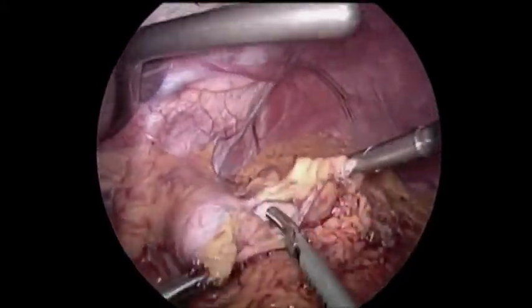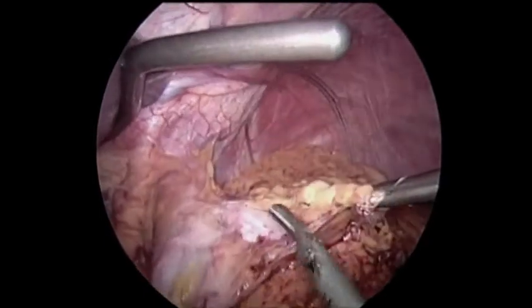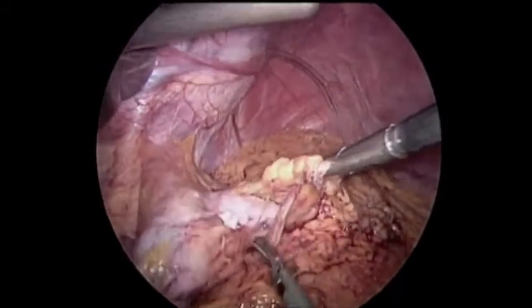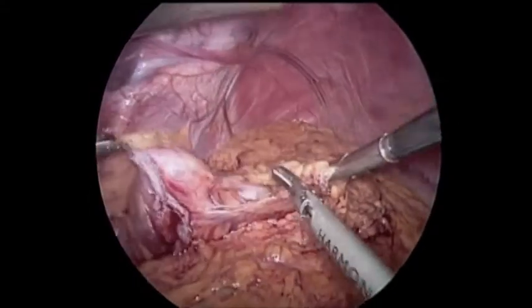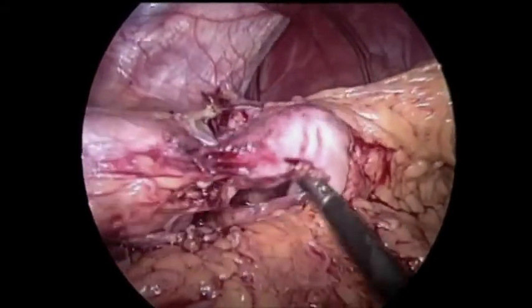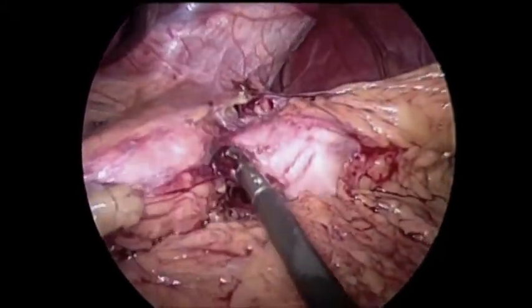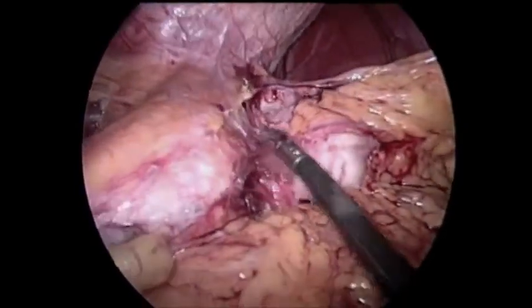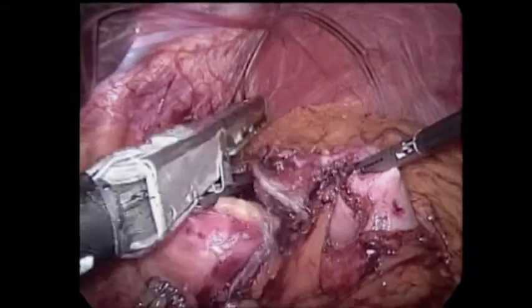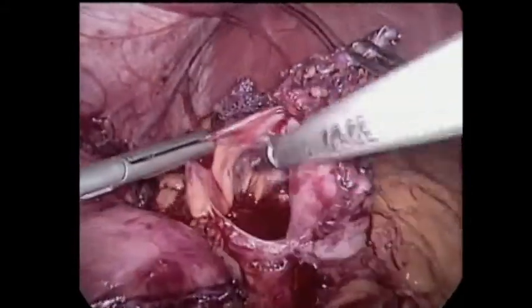Looking back up toward the gastric pouch — we had divided the lower part, so the pouch was now about 4 centimeters long — it was quite densely adherent. Whether it's a VBG or a prior gastric bypass, these staple lines are very adhesion-forming. The gastric pouch on the left of the screen was quite densely adherent to the gastric remnant on the right. I did my best to carefully dissect and separate the two, but they were really stuck. I was nervous about making a hole in the stomach and also concerned there might be a gastrogastric fistula, although we had not seen one on preoperative endoscopy or imaging. Because of the density of the adhesions, I felt it was safest to go through this with a stapler using a green load. After two firings, we were able to completely separate the stomach pouch from the remnant.